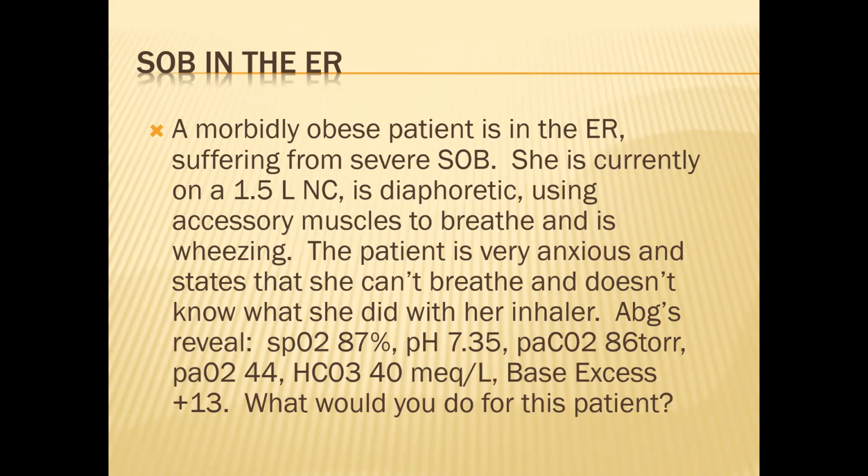Would it be hard to take a patient off BiPAP? Because I know with the ventilator, it's hard to wean them off of that. You become more dependent on it. With BiPAP, you try to do the same thing with the oxygen.